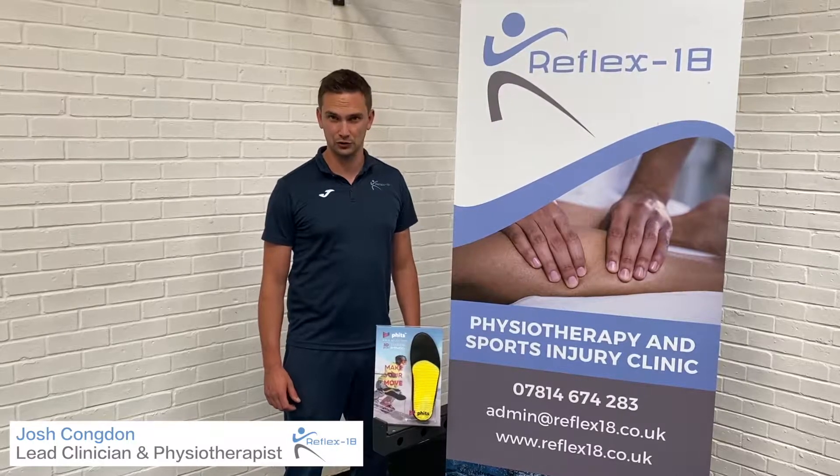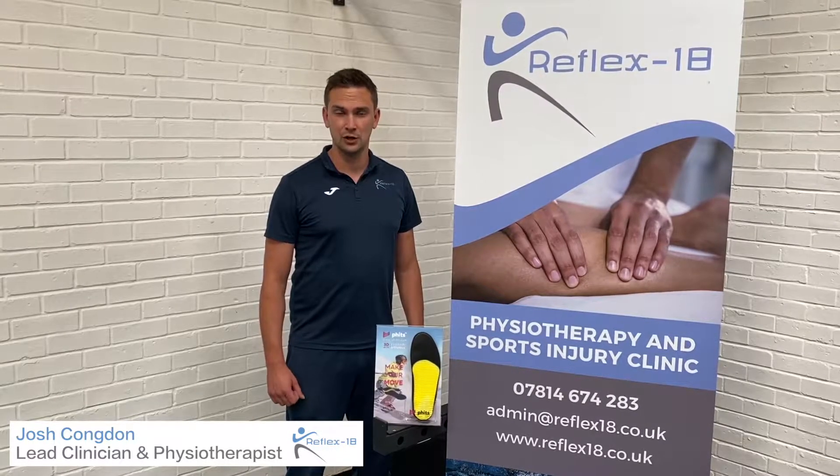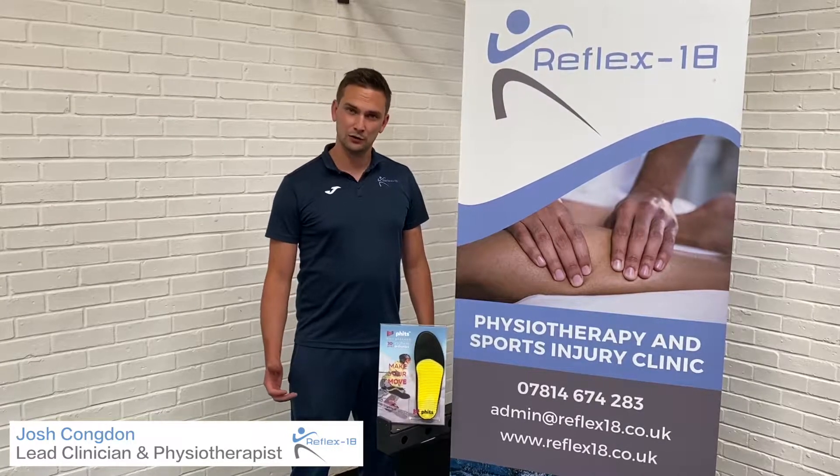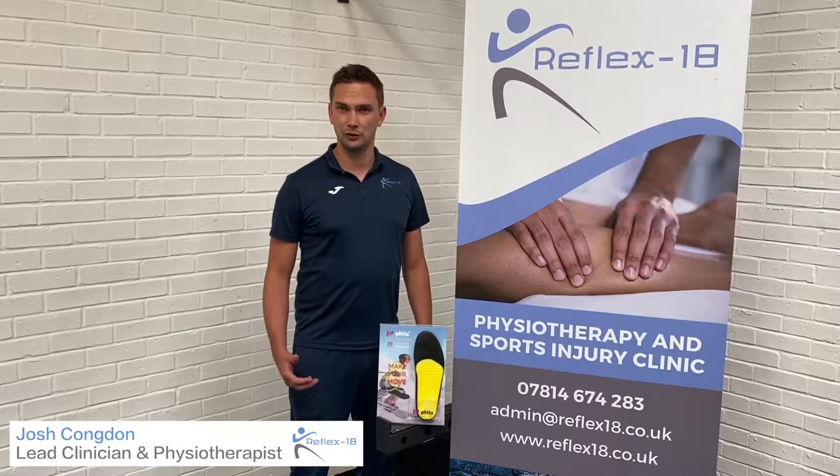Welcome to the Reflex-18 Sports Injury Hub here in Stanway in Colchester. We're a team of clinicians that work together to get you back to your best. Today I'd like to talk to you about a piece of technology called the RS Foot Scan.